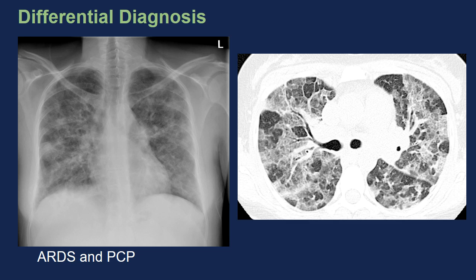Here is another case of ARDS and Pneumocystis carinii pneumonia in a patient suffering from HIV infection. Here you can clearly see the crazy paving with some normal parts adjacent to pathological parts.